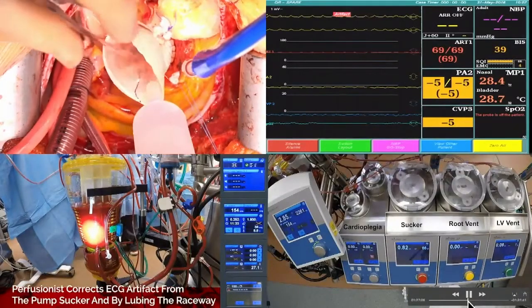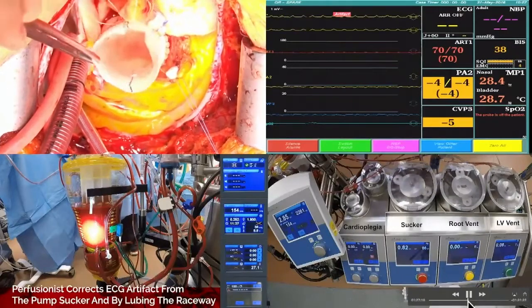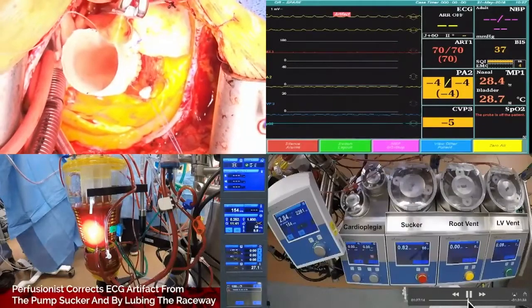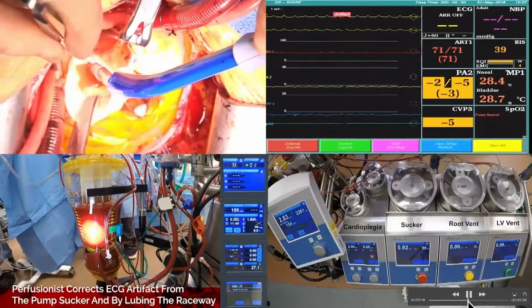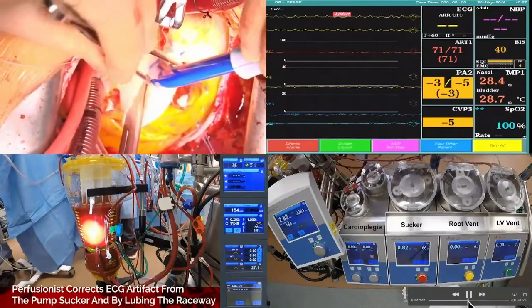What we've got to show you here is there's the artifact, which we noticed. So look here, the saline's staying in there. Oh, it looked like it was going to work. It looks like it's going to work. Yep. So once I got the leaflets to do what I wanted them to do, it looks pretty reasonable.